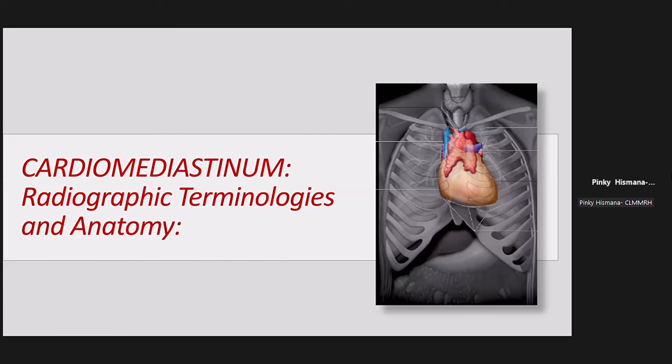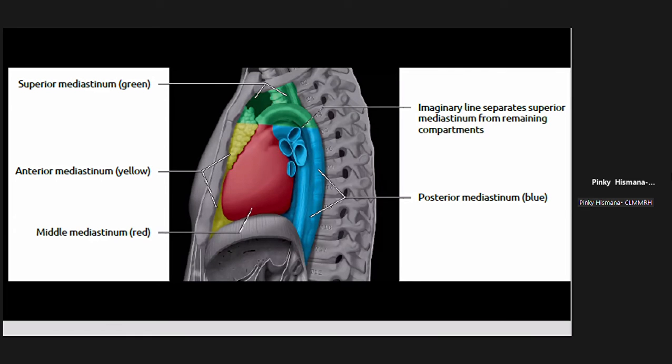Okay, let's now proceed to cardiomediastinum. Terminologies and anatomy. Radiographically, the problem is that the division for the different compartments of the mediastinum is different based on different books.